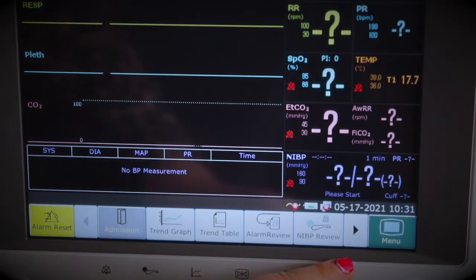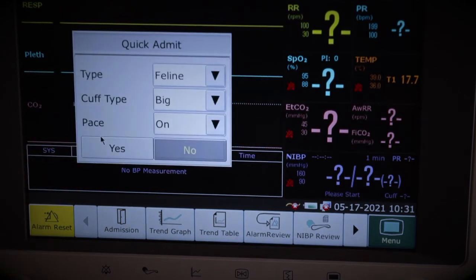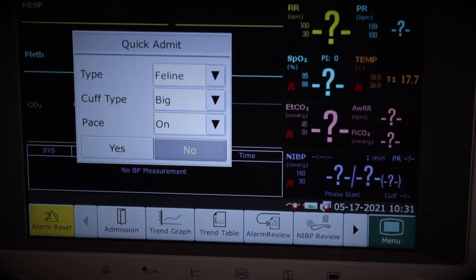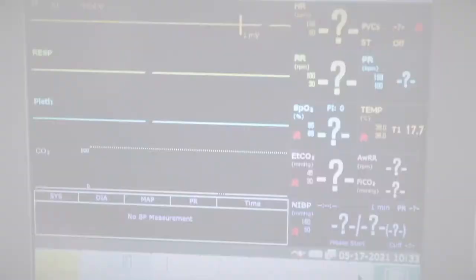I'm going to talk you through the touch screen menu at the bottom. First, we have an admission button. Clicking it brings up a pop-up to clear current patient data and create a new profile. Clicking yes brings up a quick admit pop-up, which gives you just the important fields — type and cuff type. So in an emergency where you don't want to enter a patient name, you can just select canine or feline and cuff type and click yes.